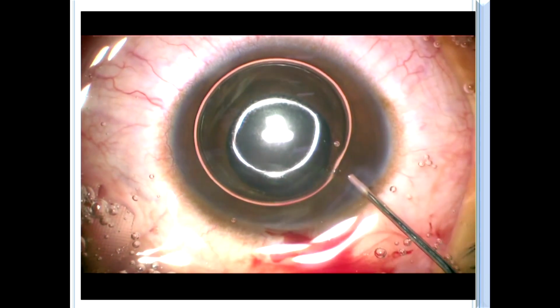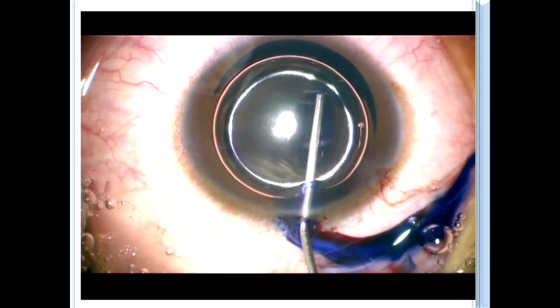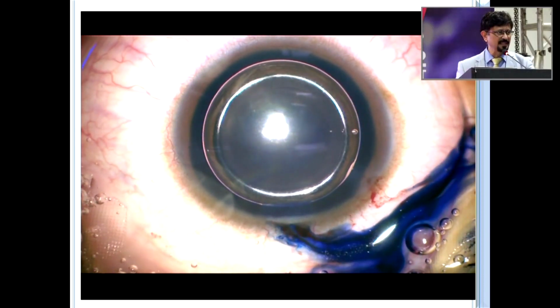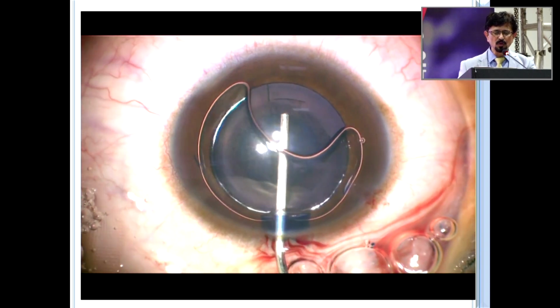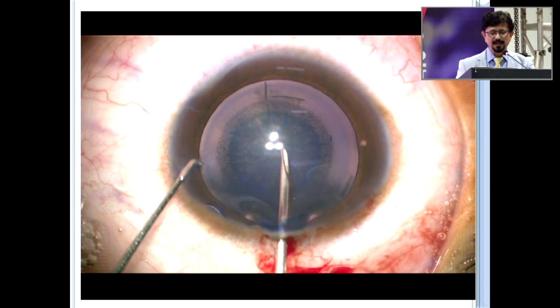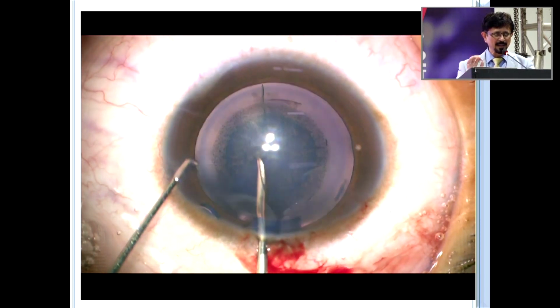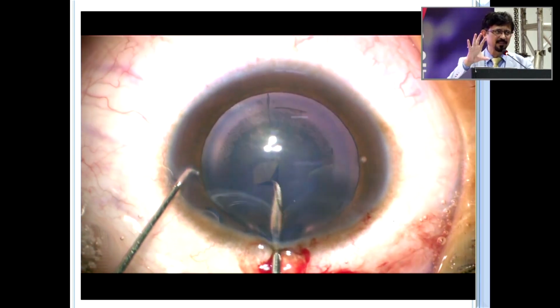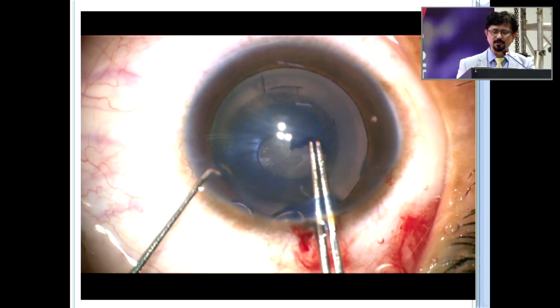Sometimes the pupil may not be dilated fully, so you have to inject a little bit of intracameral adrenaline. Before you do that, you have to tell the anesthetist that you are injecting that. And then it is good to stain the capsule with trypan blue dye, not only to have better visibility, but also because after staining with trypan blue dye the capsule becomes a little less elastic. This is what we have observed.